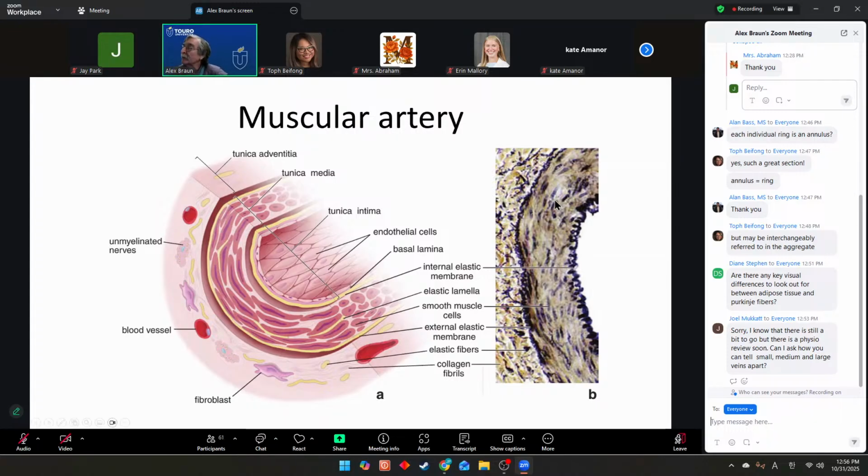If you look at this particular image here, you see a very distinct internal elastic lamina. That's one thing that's fairly characteristic of muscular arteries. The internal elastic lamina is easy to find usually. There are many layers of spindle cells here in the media, which is fairly prominent in these vessels. These are essentially smooth muscle cells. That's why they're called muscular arteries. And here's an adventitia. Now, in the larger muscular arteries, you will also see an external elastic lamina, which I do see here. But usually it's the internal elastic lamina, which is most reliable for identifying and most easy to see in the muscular arteries. And that's what we're seeing here.